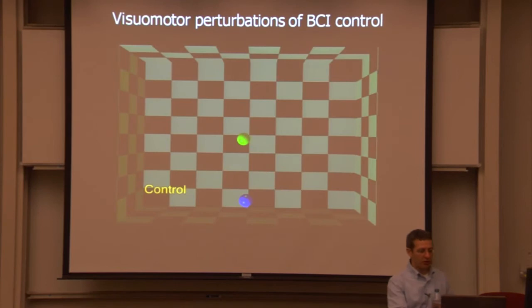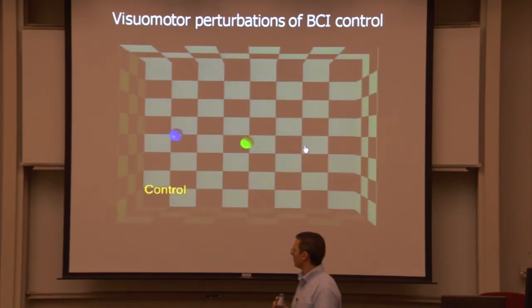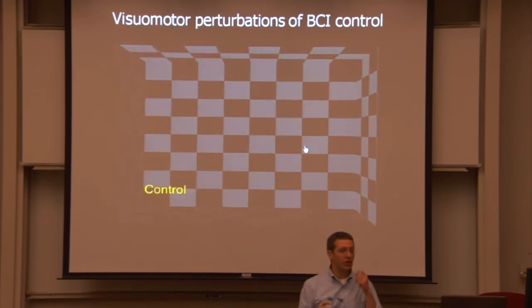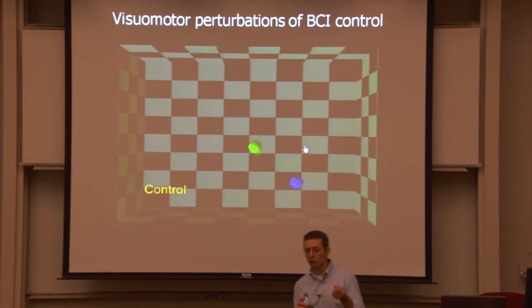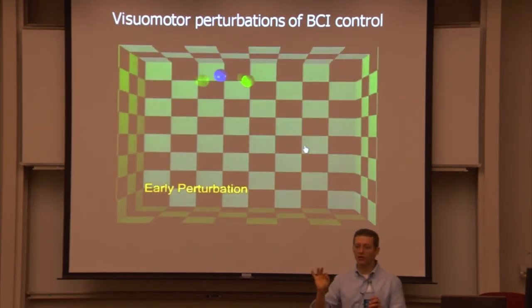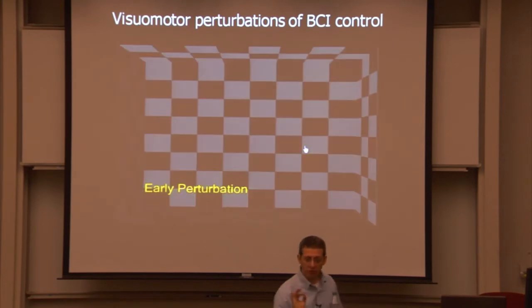And this is what an experiment looks like in real time. What I'm showing you here is the control session we run beforehand to get the monkey familiar and just pushing the cursor around. You'll see during control, he's very, very good at making straight movements towards that target. His movement time is roughly less than a second, which includes his reaction time. Now, in a second, you're going to see two things. You're going to see that solid cursor, which is what the monkey sees, and you're also going to see this ghosted cursor, which is what would have happened had we not perturbed the system.